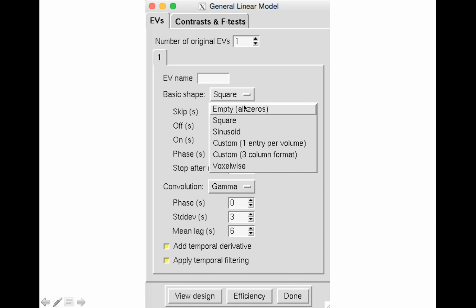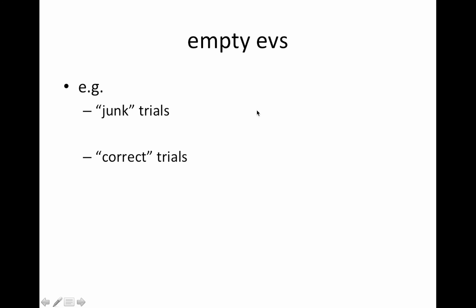Referring back to the analysis we ran, under the basic shape option we chose the three-column format option, which is typically what you'll end up using. The first option here is 'empty all zeros.' So why would you need an empty EV? It could be something like junk trials or correct trials. You might have a subject who doesn't have any junk trials and another who does, so you want to keep your analyses consistent across subjects — not really for statistical reasons, but more to keep your contrast numbers and naming convention consistent across all of your subjects.